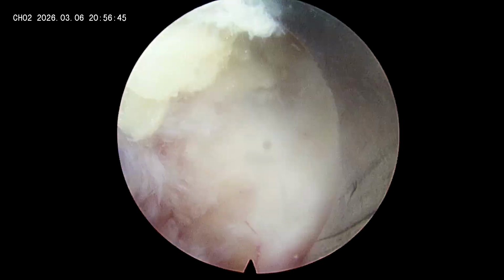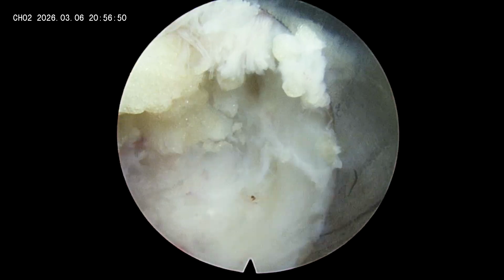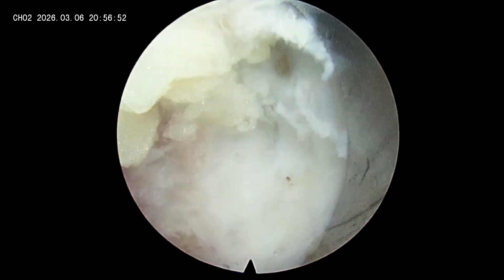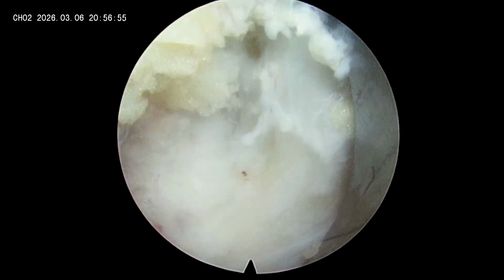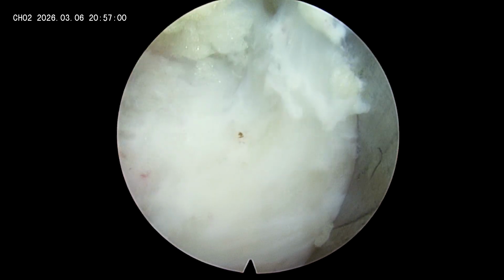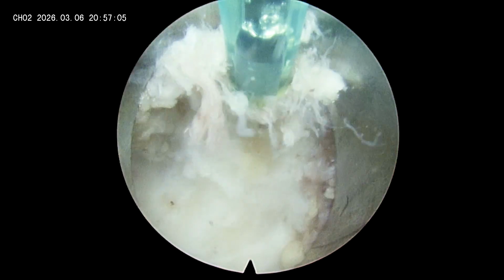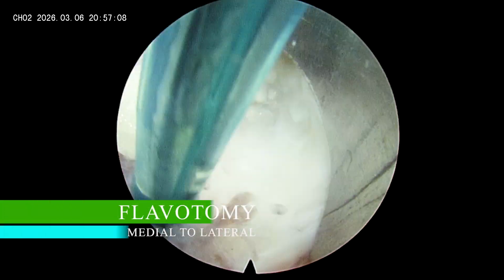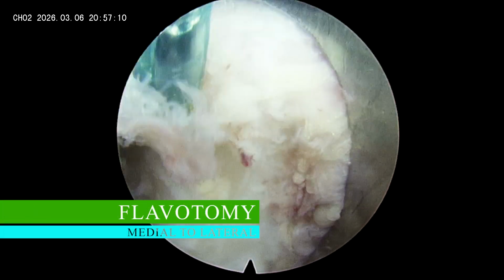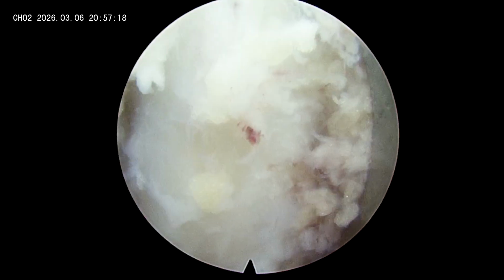So I'm just moving towards the inferior side. This is the fat which lies medially over the ligamentum flavum. So here I am just clearing the soft tissues from the interlaminar window and preparing it for the flavotomy incision. So we have almost adequately identified all the landmarks. We have adequately removed the soft tissue from the interlaminar window.